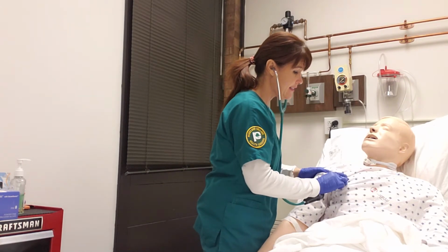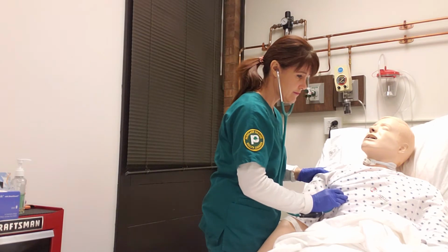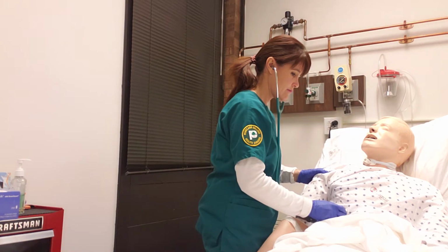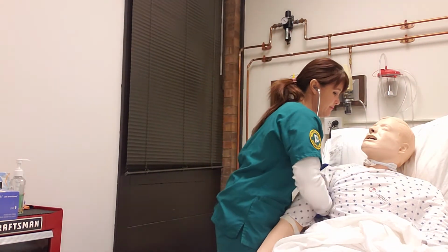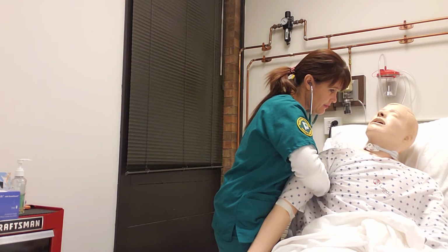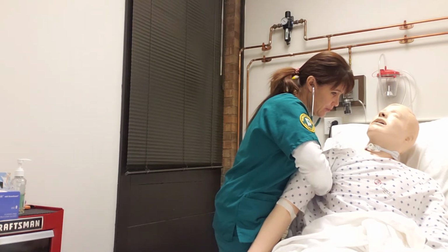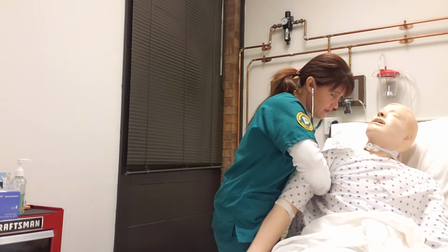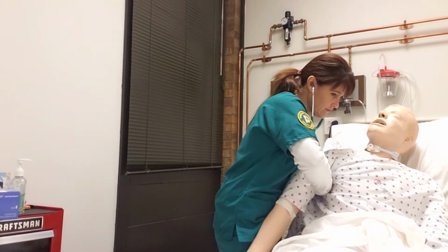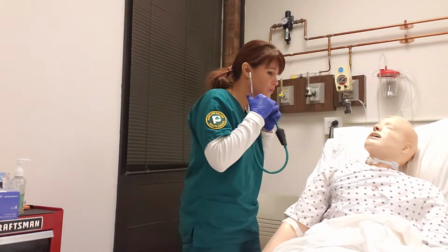Okay, I need you to breathe nice and deep for me. All right, let's get back here. Okay, nice deep breaths. Doing great. Okay, keep with the nice deep breaths. All right. Hey, Mr. Wilson, a little wheezy there.